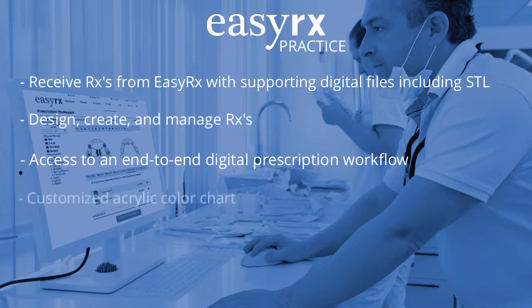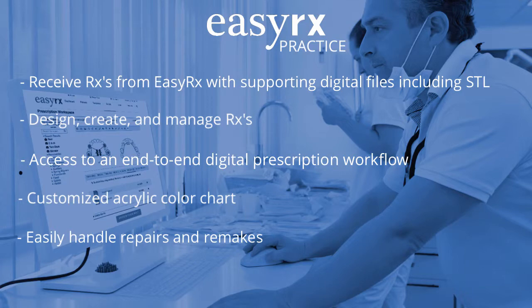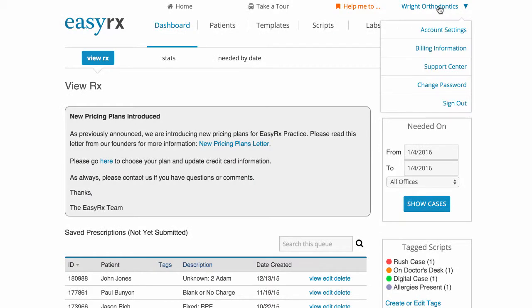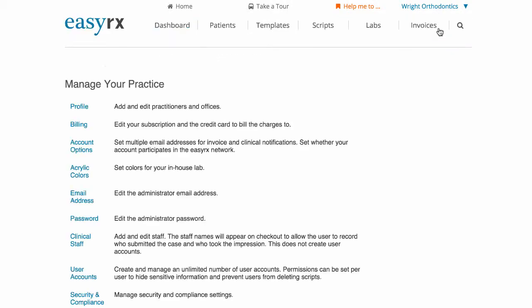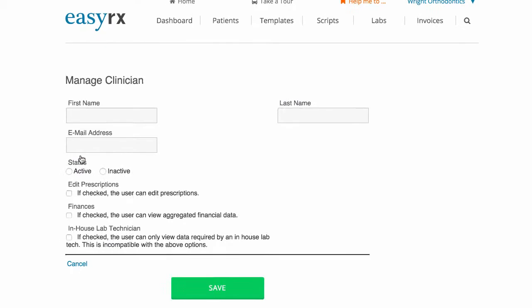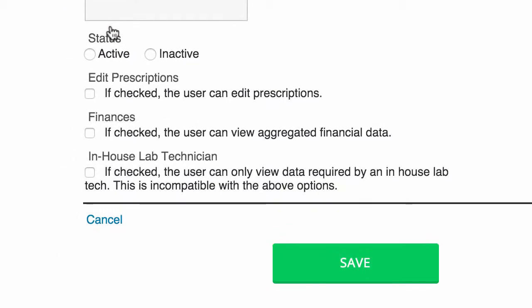You can customize an acrylic color chart, easily handle repairs and remakes, and create users and assign rights. You'll first want to create technician accounts. At the top of the screen, choose account settings, click user accounts, create a new clinician account, and at the bottom, check the box for in-house lab technician.